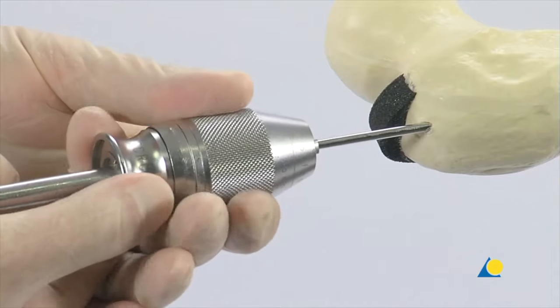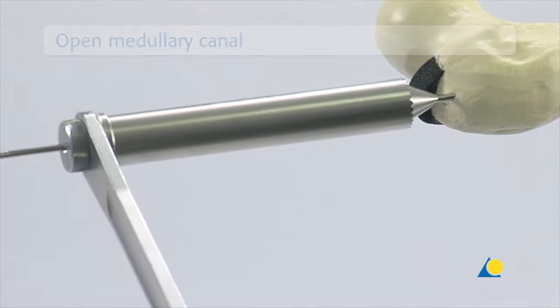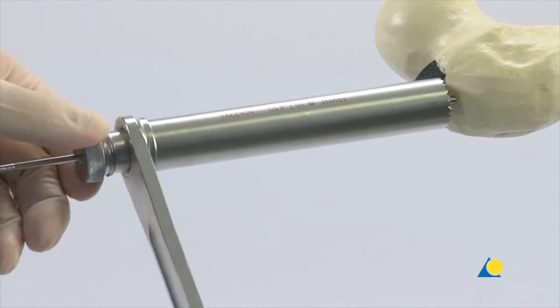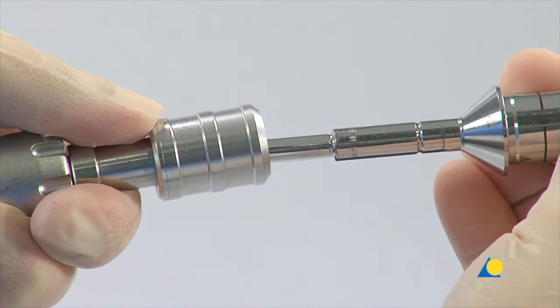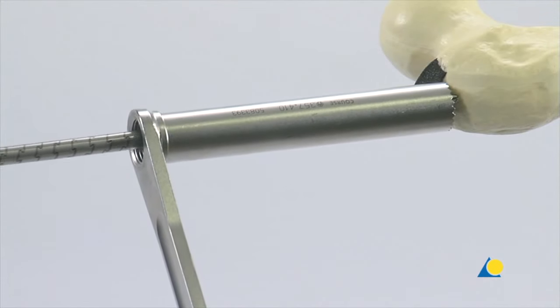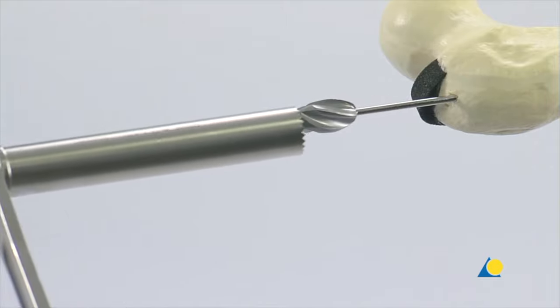After the position of the guide wire has been verified, the universal chuck is removed. To prevent damage to the soft tissue during the reaming process, the drill sleeve and the protection sleeve are passed over the guide wire through the incision down to the bone. The drill sleeve is unscrewed and removed. The flexible cannulated drill bit is connected to the DHS quick coupling. The drill bit is then slid over the guide wire and through the protection sleeve to the bone. The protection sleeve is essential for this part of the procedure, but in this exercise it is withdrawn to allow a better view.